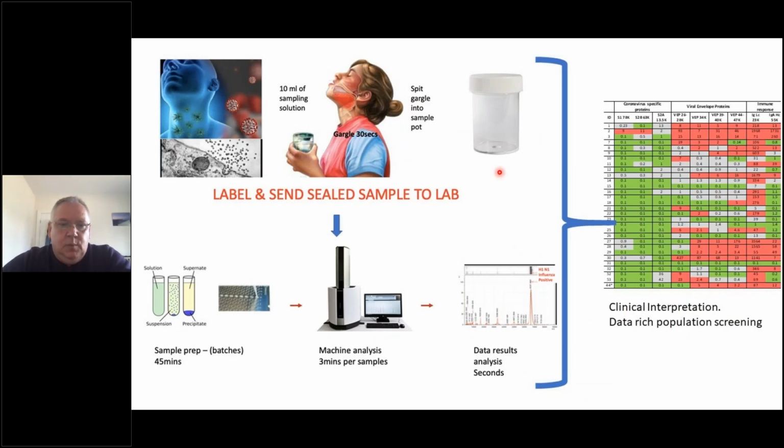And when we came to analyzing the spectra, we could see viral envelope proteins that could arise from a number of different viruses, because you've got a lot of bacteria in there, you've got lots of different viruses that may be present. You could see whether there is immune response from the IgA heavy chain, the IgA light chain, and then we were looking for the specific S1, S2, and S2-like fragments, which I'm going to elaborate on in a minute, present in your spectra. And we could do a heat map. We were looking at the bioinformatics that would be needed.